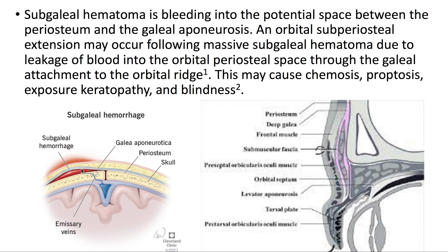An orbital subperiosteal extension may occur following massive subgaleal hematoma due to leakage of blood into the orbital periosteal space through the galeal attachment to the orbital ridge, as depicted here.